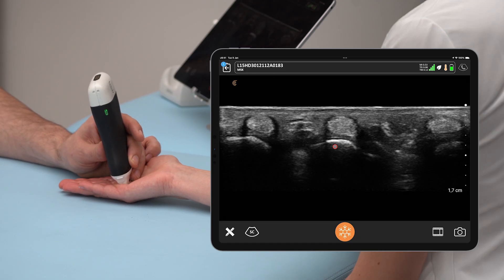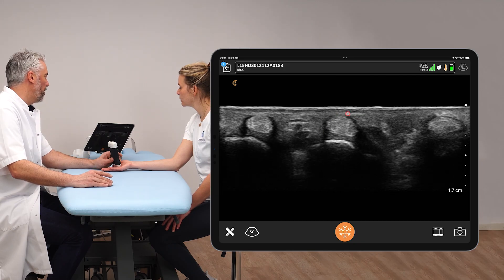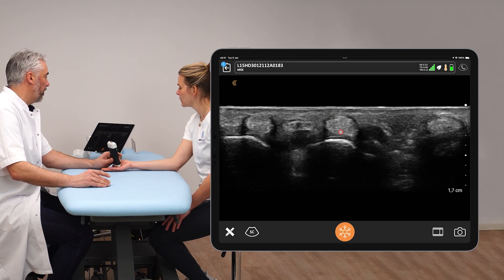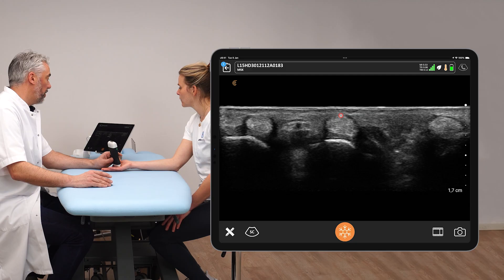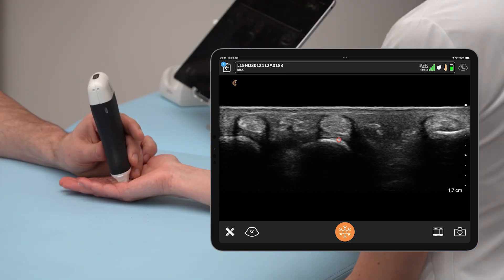In the transverse view, we can see the convexity of the metacarpal head with the flexor tendon on top, a little bit of volar plate in between, and the tendon sheath and pulley system on top. We're going to observe the cross-sectional area of the tendon and also the thickness of the pulley — whether it is increased, or whether it is torn.